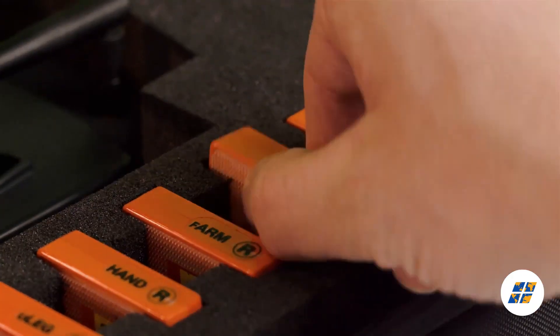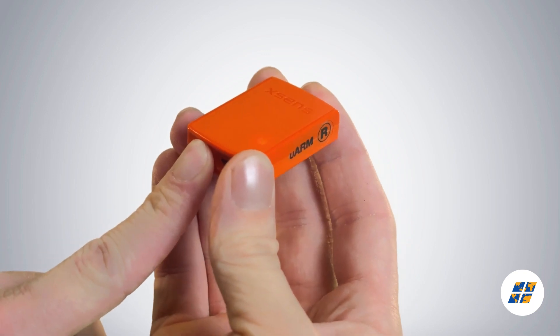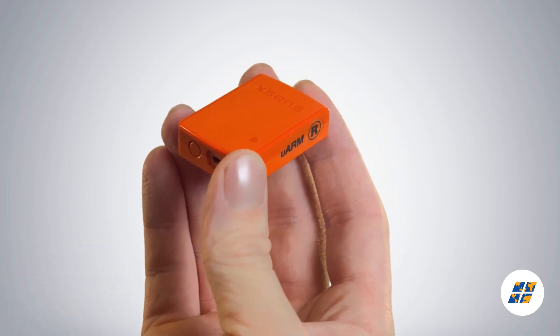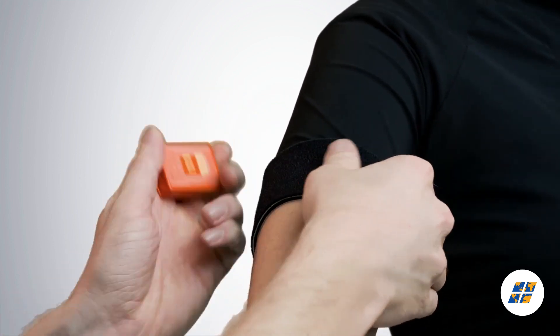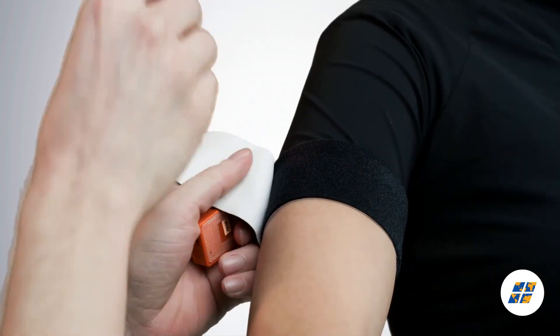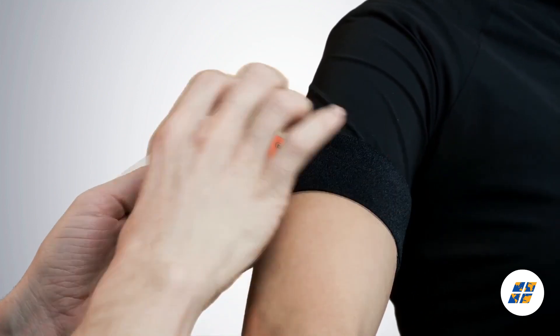Let's start with the wireless motion trackers. To power on the motion trackers, press the button and wait for the light to start blinking. In this training video, we place the motion trackers on top of the straps to demonstrate the correct position. However, you should always place them underneath the straps to get the best results.